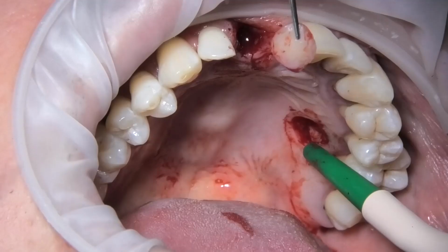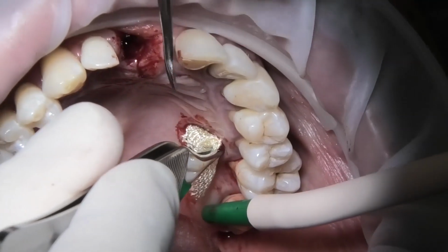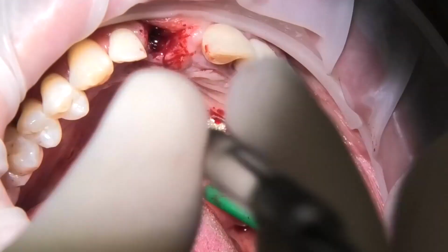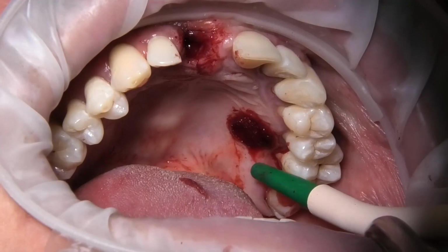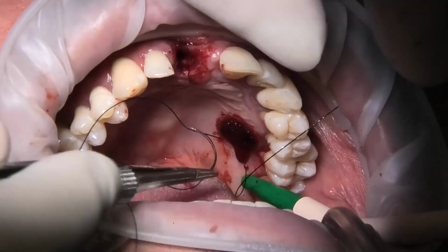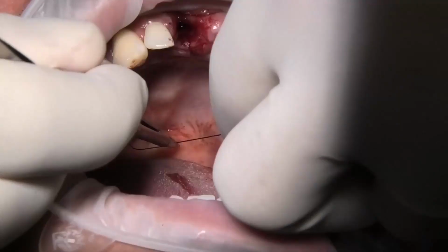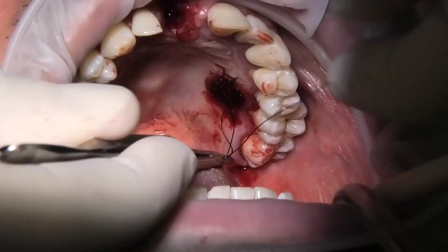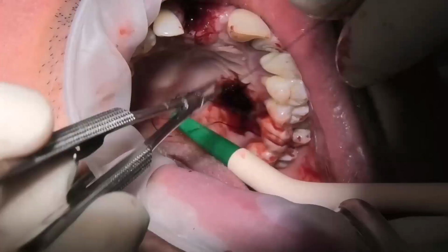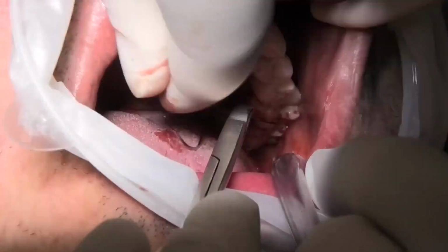Once the sampling has been carried out, to obtain hemostasis of the site we place oxidized cellulose, blocked with cross stitches and suspended from the teeth. So this is the moment of the suture. We go in a distomesial direction, and to block, we obtain the hemostasis quickly. And hemostasis is almost immediate after this, and this is the palate.